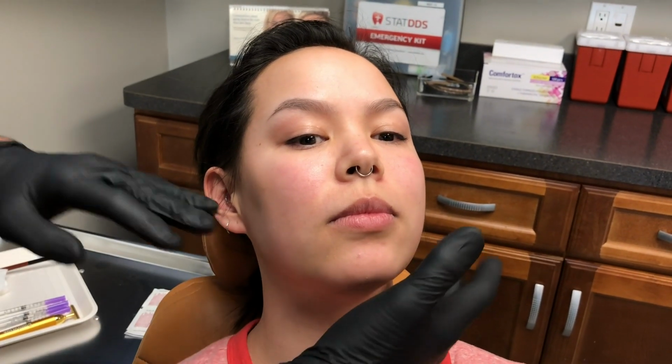Right, and I think last week, and we're just getting to you now, I'm sorry, she said, my Masseters are killing me, my jaw muscles are killing me. So we're gonna go ahead and give her some Botox in her Masseter. Let me just show you a little bit because the actual treatment is gonna be incredibly quick here.